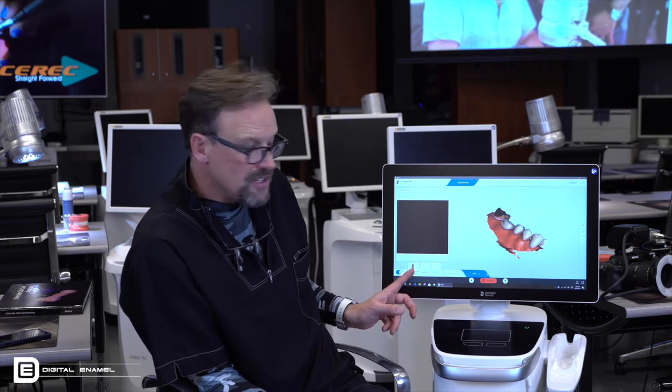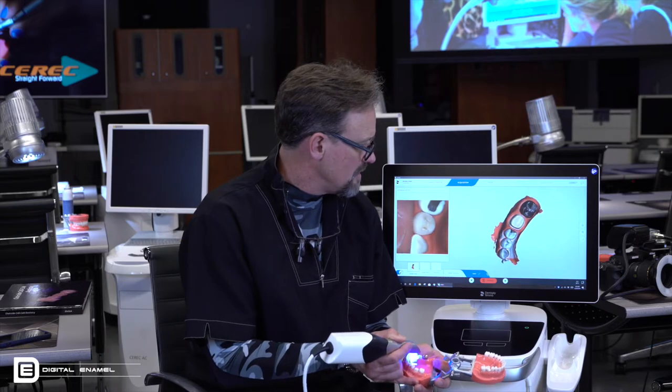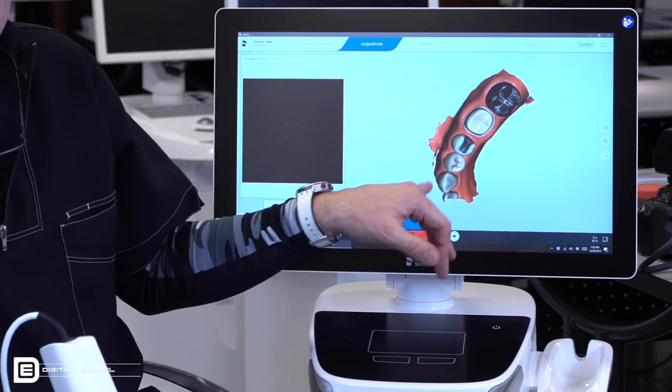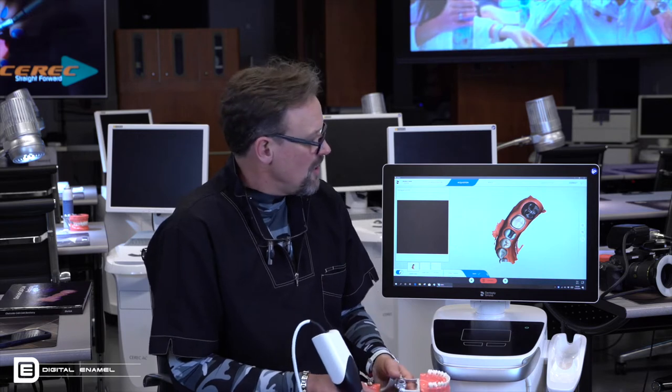Now, if you start getting too much data on top of data, what will happen is you'll start seeing in the little catalogs, it's trying to patch one video, let's call them videos, one video on top of another video on top of a video. Well, if you throw in a cheek, okay, let's say my big finger got in the way, and CEREC has the feature that it's going to start taking things out. Now you're telling CEREC, take one video and add to the video that we already put on there, but then I'm going to throw something in there, my finger or the cheek, but then start taking it out. So you're adding a lot of processing unnecessarily. So don't make it harder on the data.